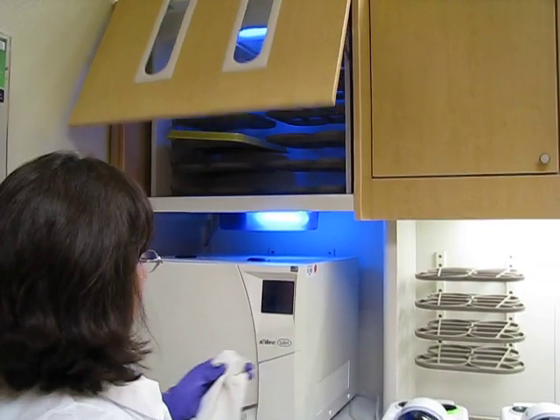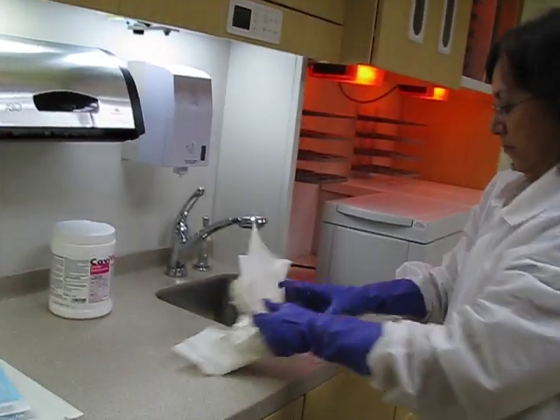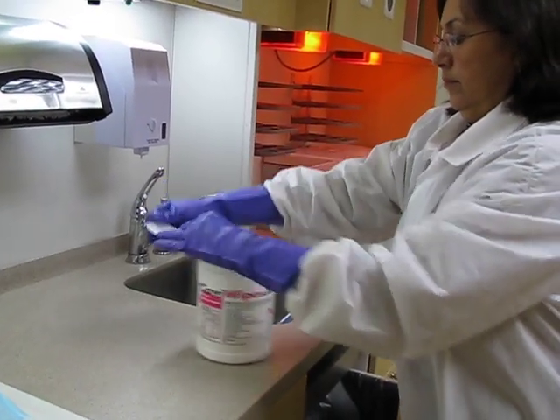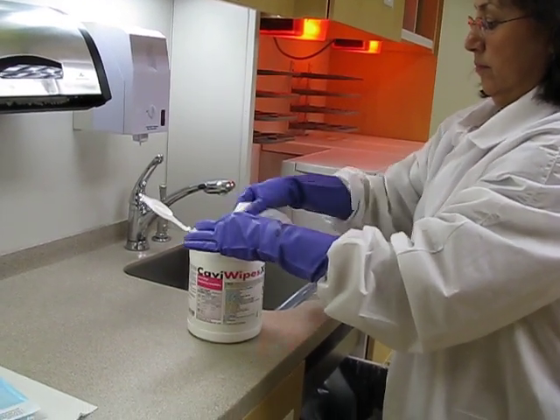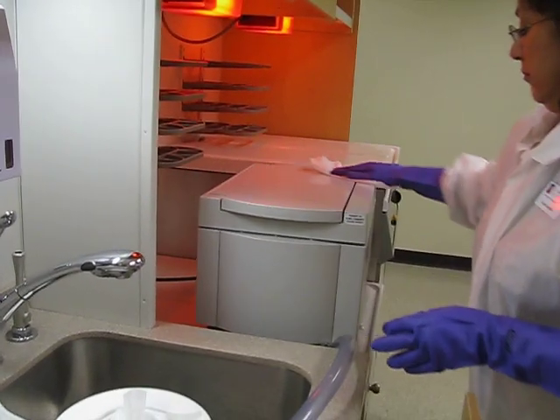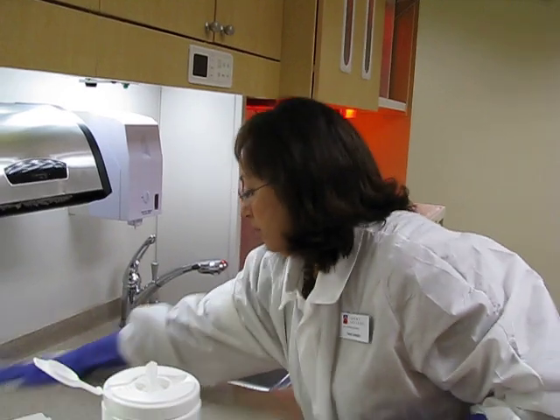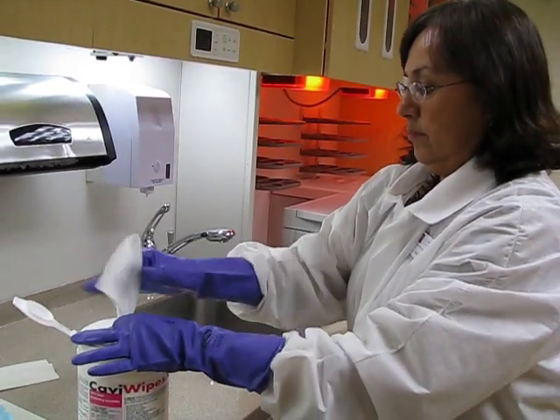The last thing she's going to do is wash her utility gloves — just like if she were washing her hands. Or you can choose to just wipe them down with a cavity wipe. She's also wiping down the ultrasonic. What's important is that afterwards, you leave them drying on top of a paper towel after you wipe down your utility gloves or wash your hands, whichever you decide to do.